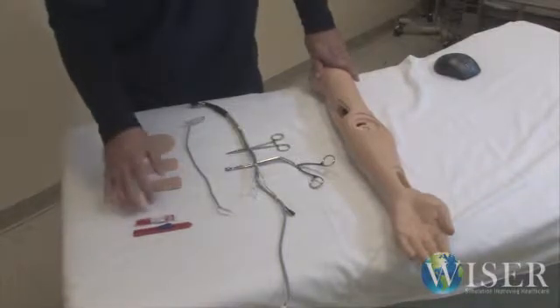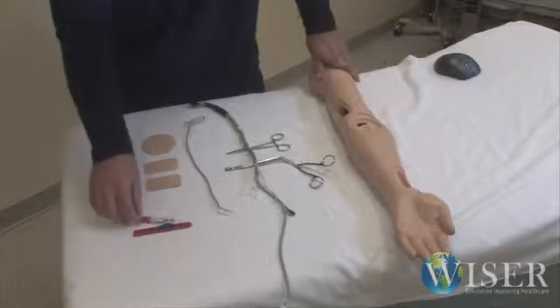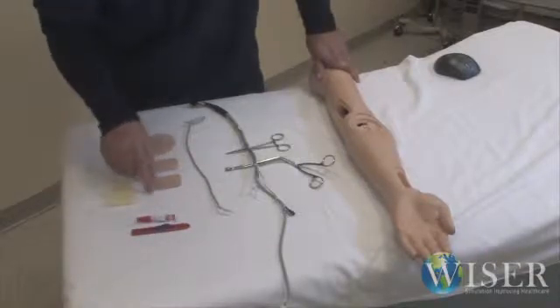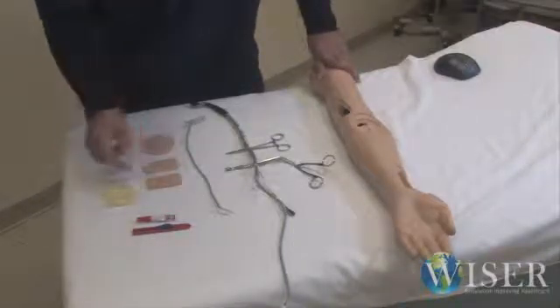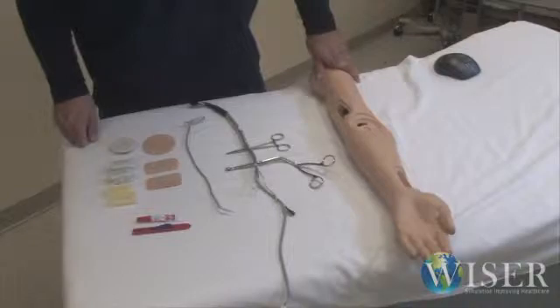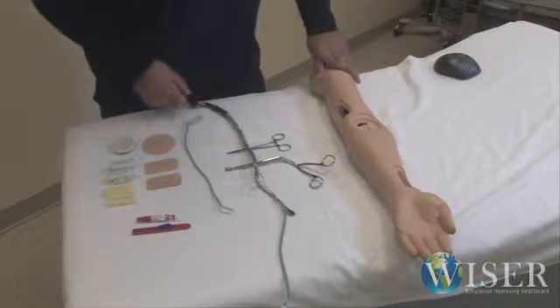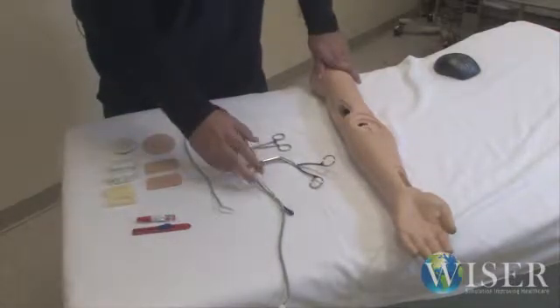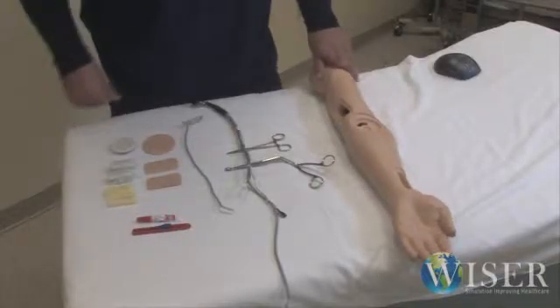Future glue, super glue, any basic super glue when we put our skin back on. And then a razor blade. This is to help remove the skin a lot easier and make sure that we do it cleanly so that we can reuse it. And then also some hemostats to help pull the different connections through the arm itself. So now let's run this wire through this arm.